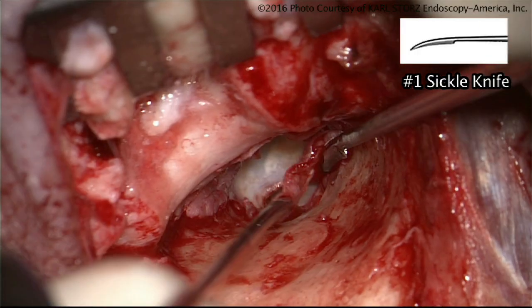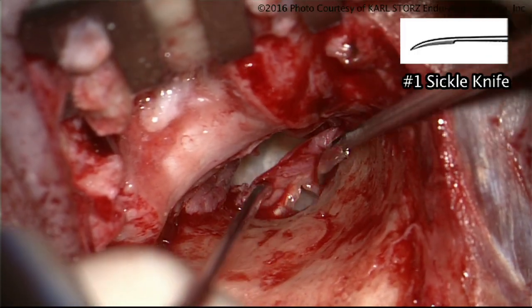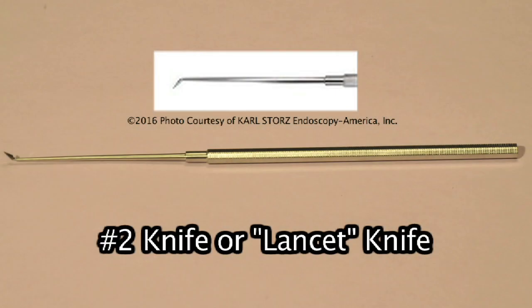I love to use this one for dissecting soft tissue — for example, dissecting the cholesteatoma off of structures in the ear. The number one knife or sickle knife works very well for that. And this would be then a number two knife.